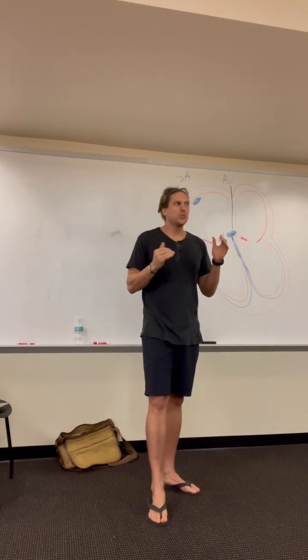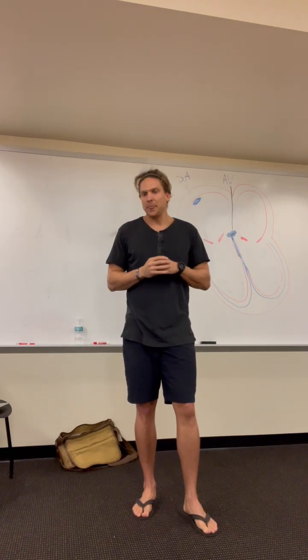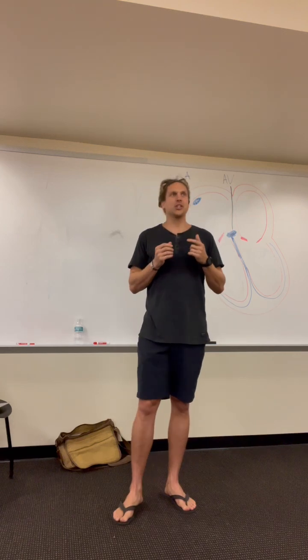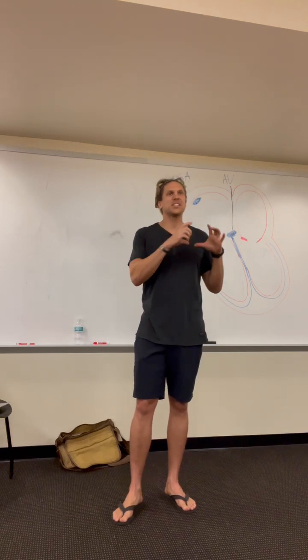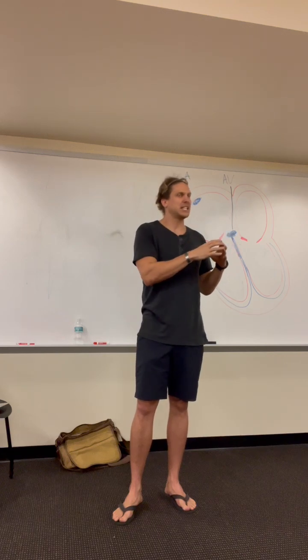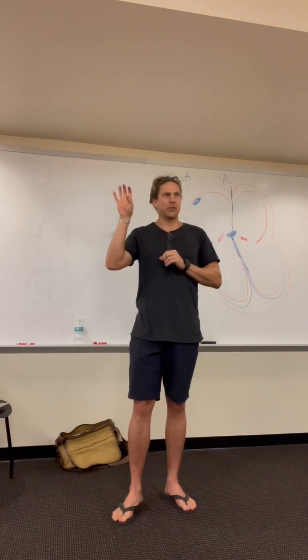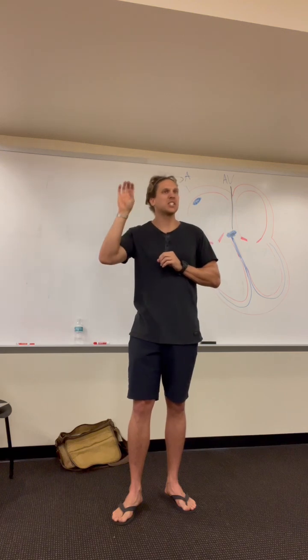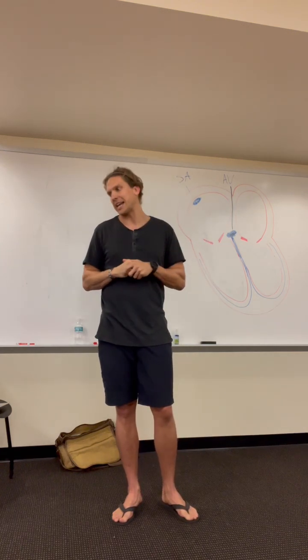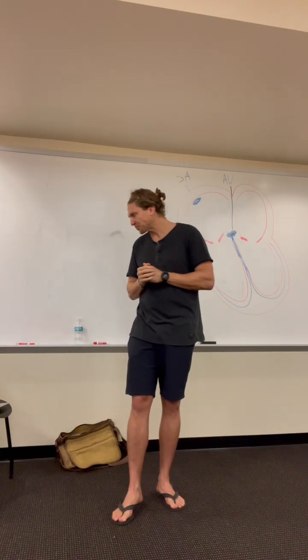But we were just remembering, like, a-flutter, there's sawtooth patterns. So at a minimum, you could try to just learn those and see if you can pass the test with those. I think just like Dr. Sotos' test, where we had the skin lesions, and he had the exact same pictures from the slides in his test, I would hope that the same will be true, that every rhythm on the test is a specific rhythm that we've seen in our slideshows or in some of the handouts that she's sent out to us. So at a minimum, you can try to just memorize stuff that way.